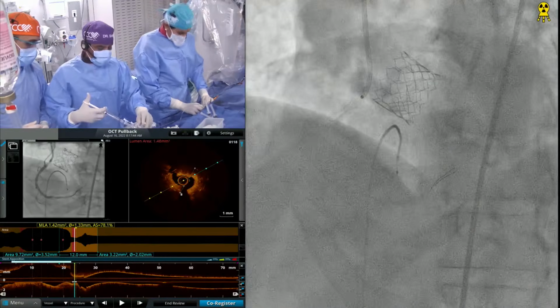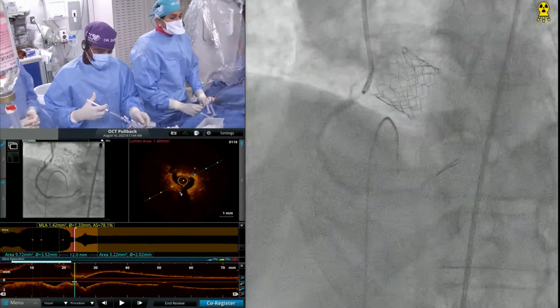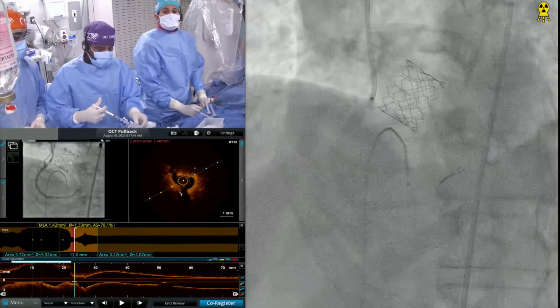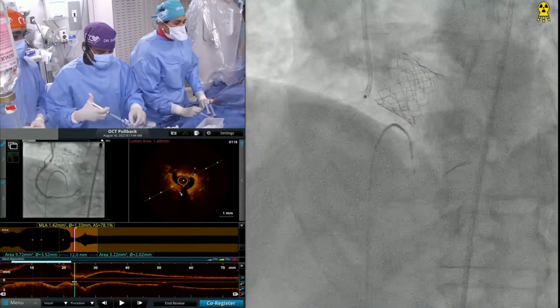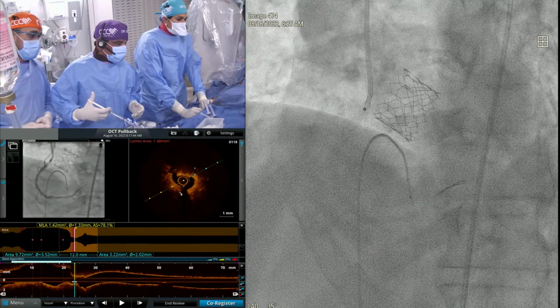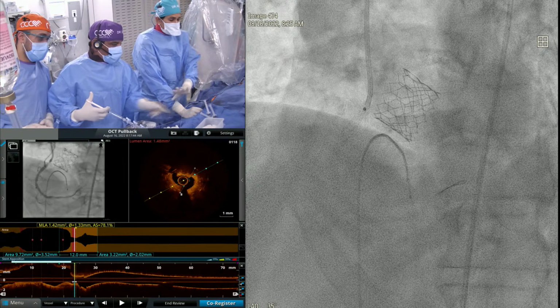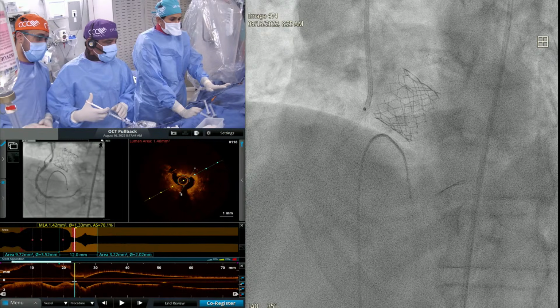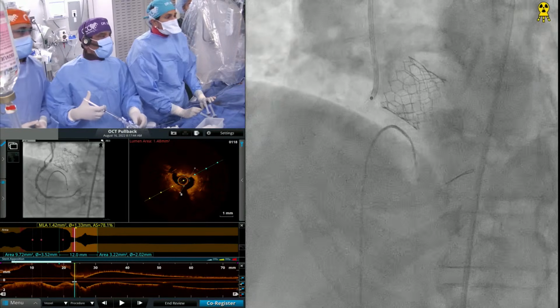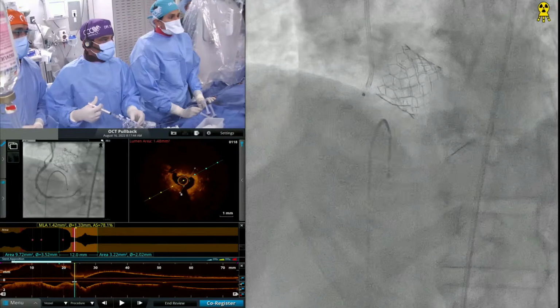Yeah, so we are going to start now. And once you say so, I'm going to start flushing. Why is it not working, my friend? Guys, it's not working. Hello? It does not show any light. Go 60-60. Quick, ready? Yeah, go for it. Okay, 60-60. No, the 1.5 goes to 40 only, I think. 60-40. Yeah, 40, remember? Okay, 1.5 goes to 60-40. The real important thing to notice is the laser catheter has to be coaxial always.